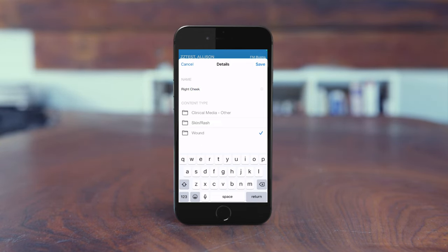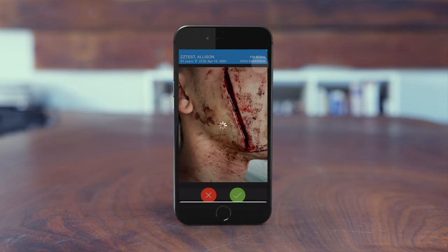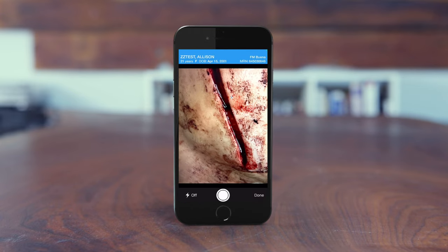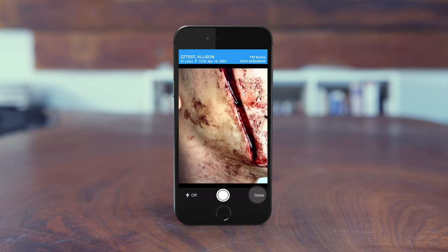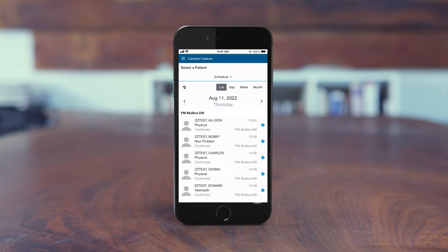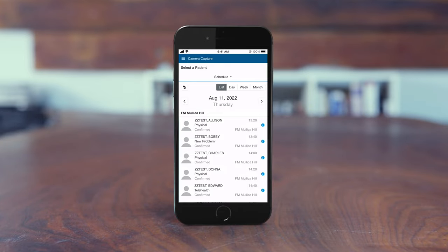When finished, tap Save. The camera activates again — take additional photos as needed, then tap Done or the back icon. Photos are immediately uploaded to the patient's record within Clinical Media and are not stored on your personal device.